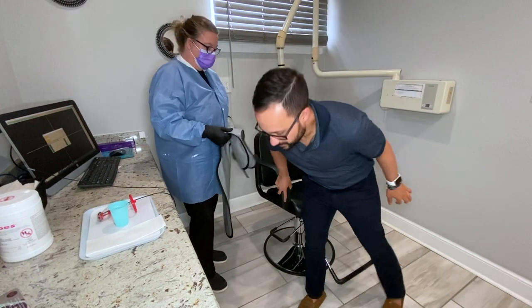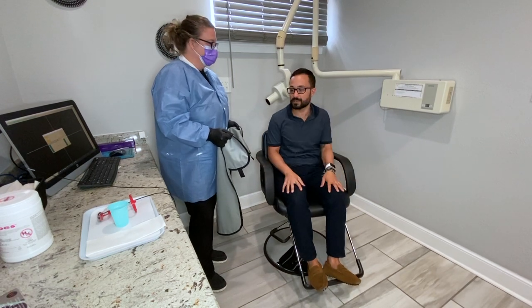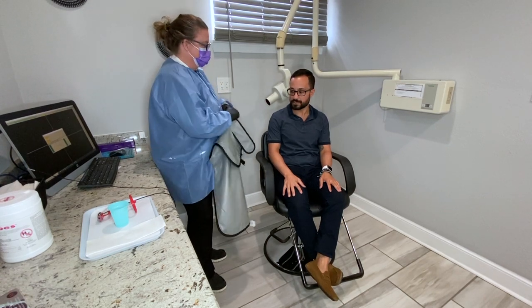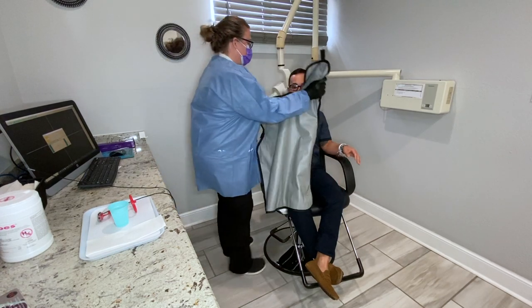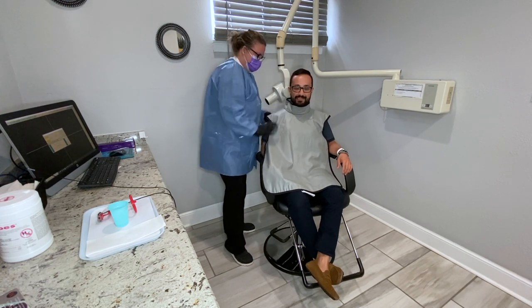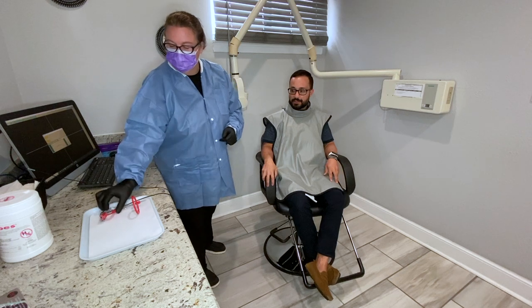Today we are going to demonstrate how to take your basic horizontal bite wings, and Teresa is going to jump right in and get going with it. First thing, obviously, get the lead apron on, and then we're going to go ahead and go right into our bite wings.